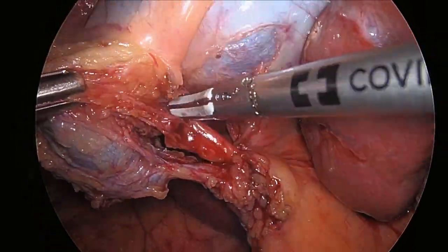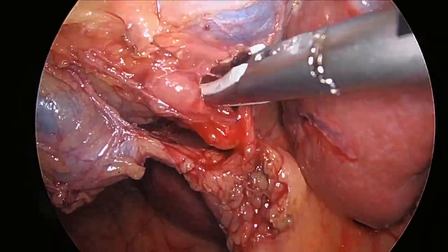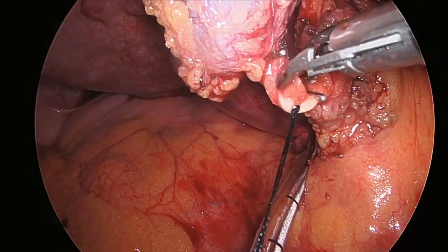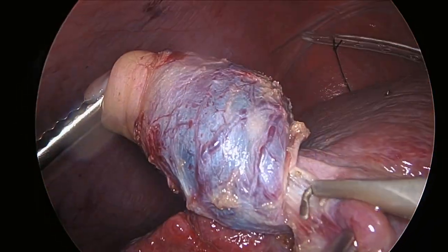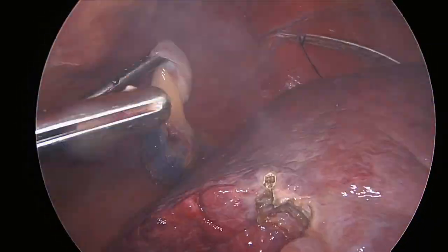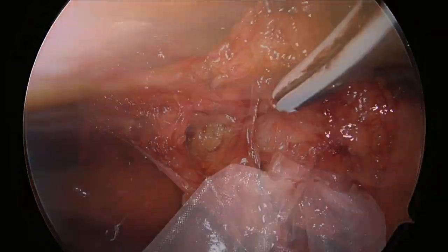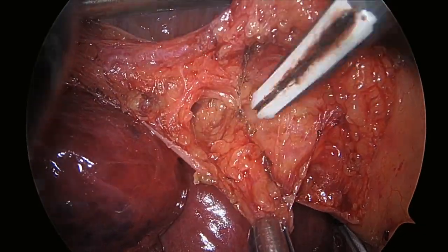A cholecystectomy is then performed. Prior to dividing our cystic duct stump, we leave a longer tie so that we can later medially retract this to help with exposure during our portal dissection. The gallbladder is then placed in an endo-catch bag and removed. We start the hilar dissection with this medial retraction on the cystic duct stump.